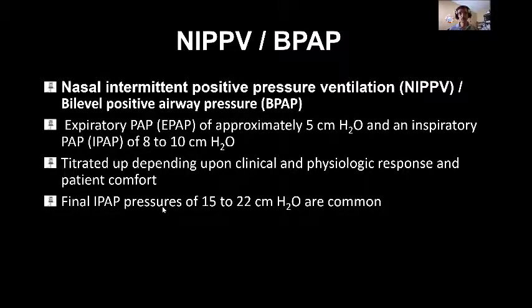Now, what is non-invasive positive pressure ventilation, or bilevel CPAP? As we said, it's providing two-level CPAP through an interface, but the interface is not an ETT. So it's a ventilation providing PIP and PEEP, but not through an ETT going inside the lung. That's what we call non-invasive positive pressure ventilation. Of course, there are two types: the conventional and the high frequency. But I'm not going to talk about high frequency non-invasive ventilation today because I haven't spoken about high frequency yet. We're talking about non-invasive conventional.